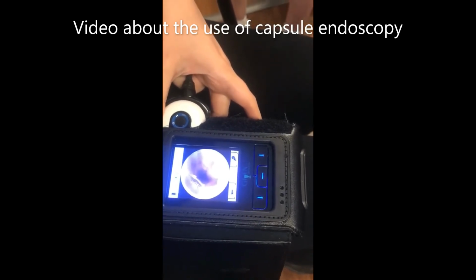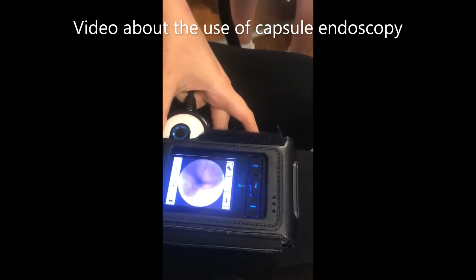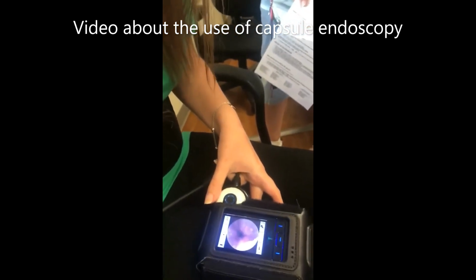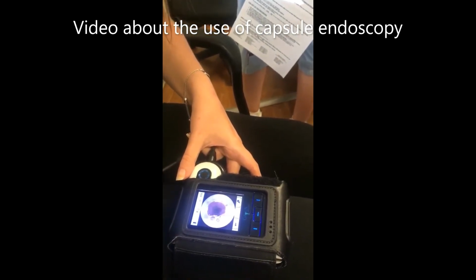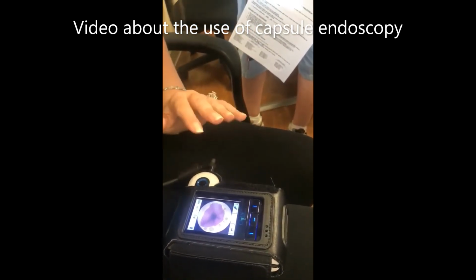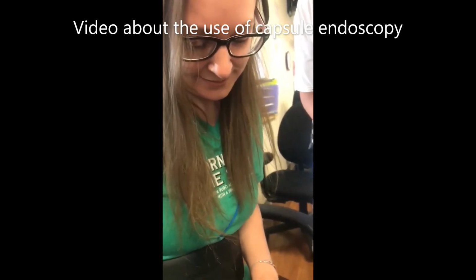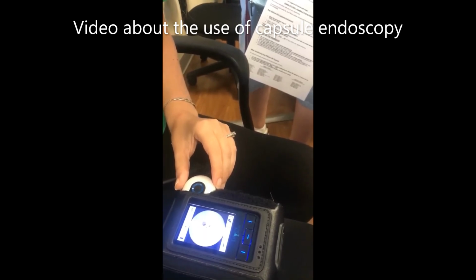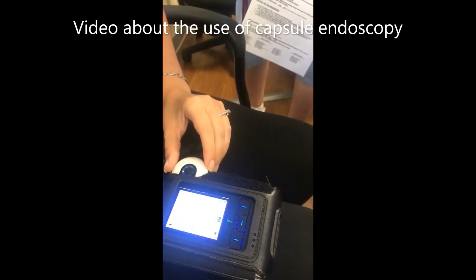Is it supposed to be laggy like that? For some people, when you swallow food, your esophagus tends to hang out with the food for a little bit until the sphincter opens up and lets the capsule through into your stomach. Sometimes it requires drinking. But it went down though. So that's your sphincter opening and closing. It's not acting like it's food pushing more food on top of more food, so it will eventually just open up and let it through.